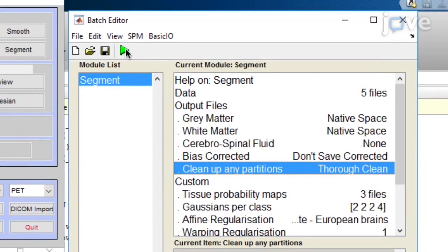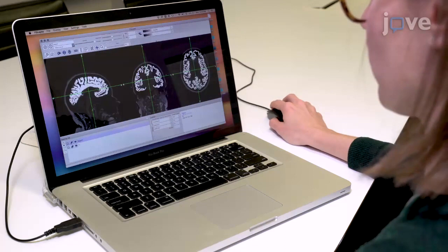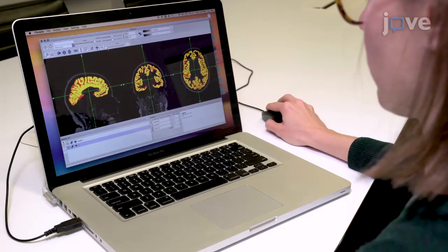The MATLAB window will say Done when segmentation is finished. Finally, perform visual quality control on the resulting Gray Matter NIFTY file.